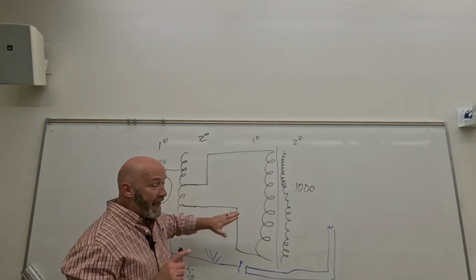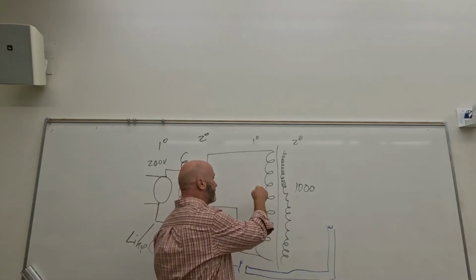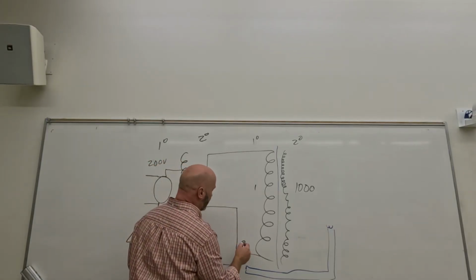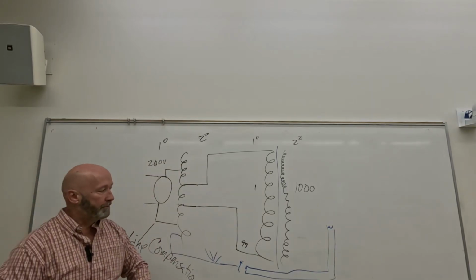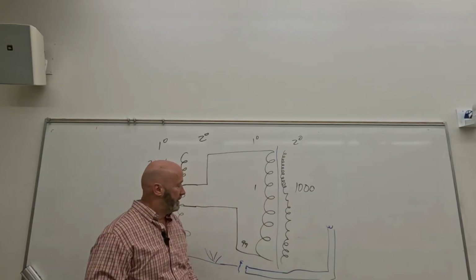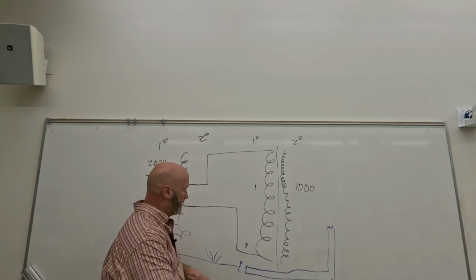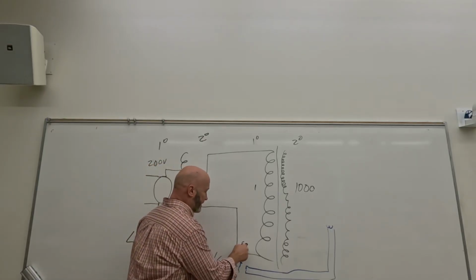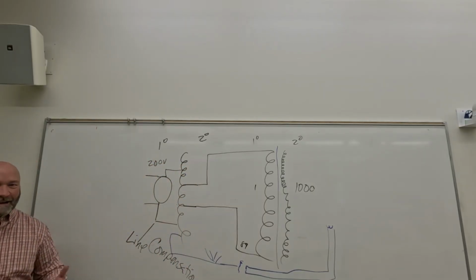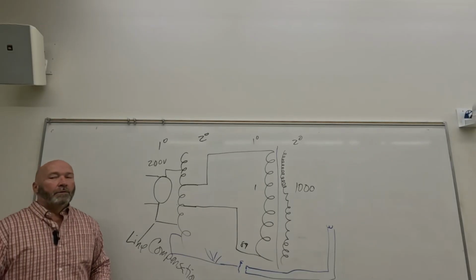So whatever actual voltage I have here, I know exactly how much I'm going to have over here because my turns ratio is 1 to 1,000, right? So if I have over here 99 volts, because my auto transformer is off, then what's my kilovoltage going to be? 99 kilovolts, right? So what if I set 100 and what I get is 89? Might that be a problem? Yeah, the 99 is not so much, but the 89 is getting a little squirrely, right? So we don't want that.